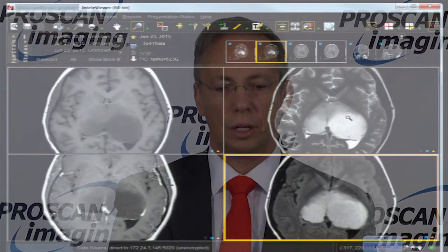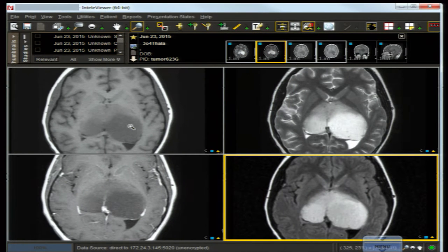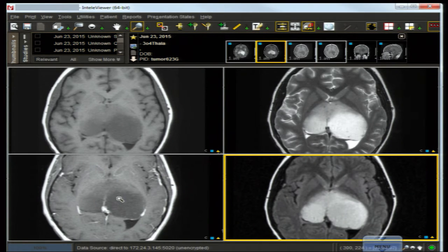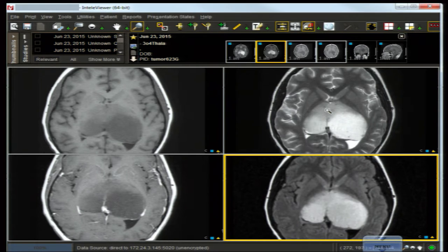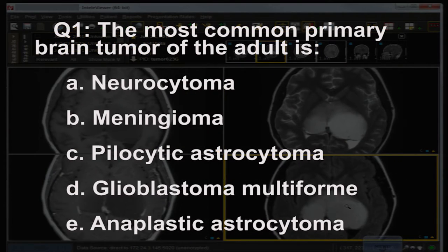Today: brain tumors and masses. We have a young adult teenager with an intracranial mass. An axial T1-weighted image without contrast shows bithalamic hypointensity with mass effect, although the ventricles are not very enlarged. Following contrast administration, there is little to scant enhancement. A T2-weighted image shows the lesion crossing the midline with surrounding perilesional edema. The FLAIR sequence adds little more to the diagnosis.